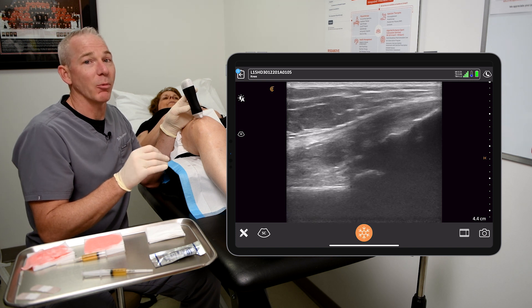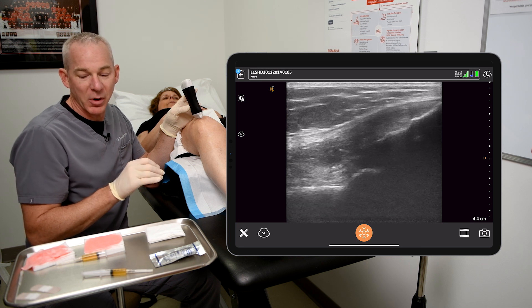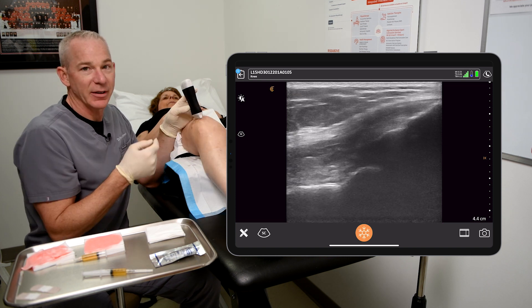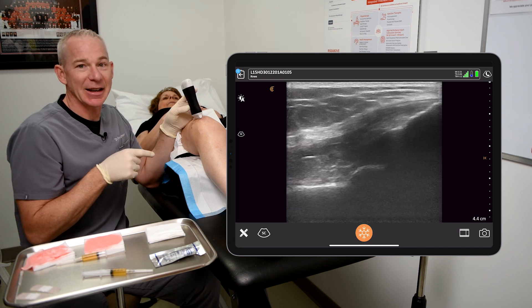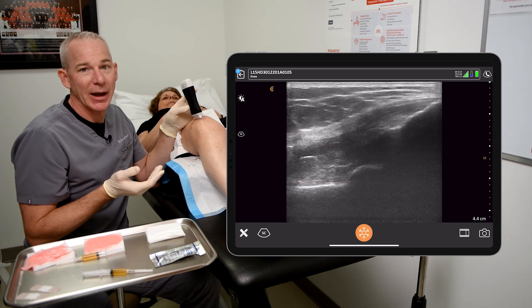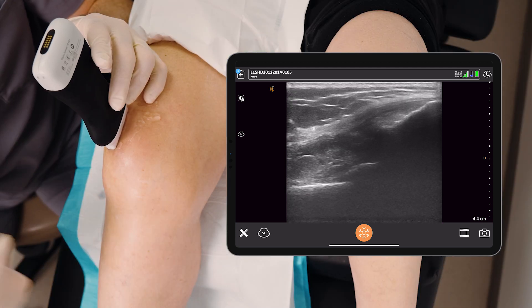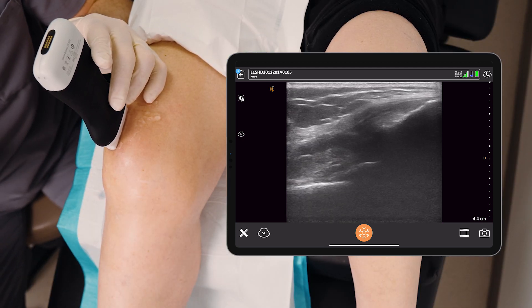The effusion we saw in part one of this video isn't present anymore. So how do I know where to inject the PRP into the actual knee joint fluid? In the old days you would simply go through the front and hope it got there. Some people advocate just sticking it in, but the trouble is if we land inside the pre-femoral fat pad the patient's going to have a big flare-up and it may not help much. Some people advocate placing it under the patella medially, and that's kind of my last approach if I can't get this one.